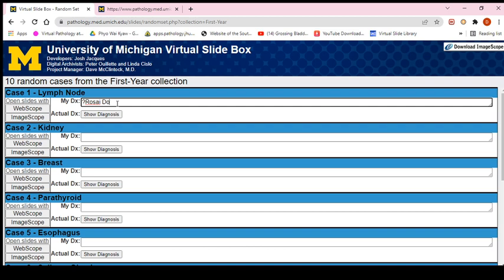Oh, it's correct. It's amazing. I didn't see the slide beforehand. These random cases change whenever you open this web page, and that I'm correct is just luck. Maybe I can be wrong next time because of these blurred photos, and I need to find out more about this.